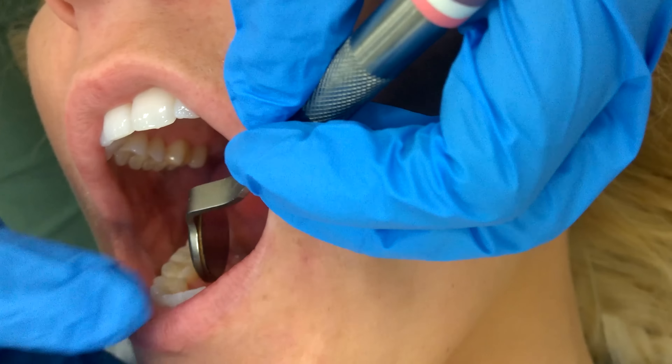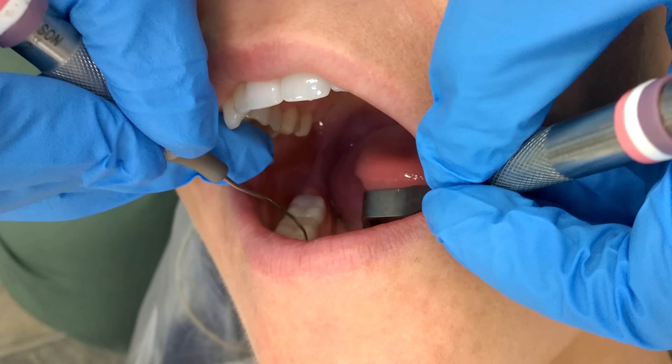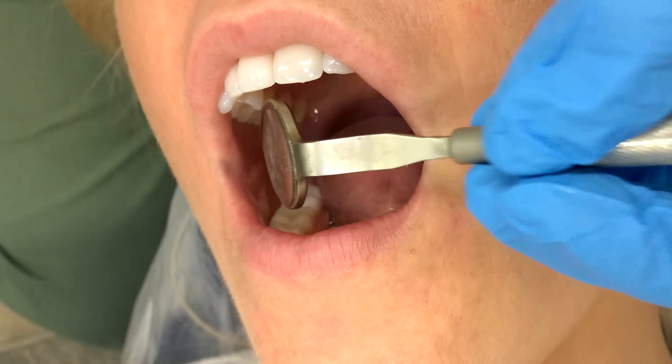You can also use it to retract the tongue. Be gentle but firm at the same time. Don't be afraid to put pressure on the tongue so that you can see what you're doing and do it correctly.